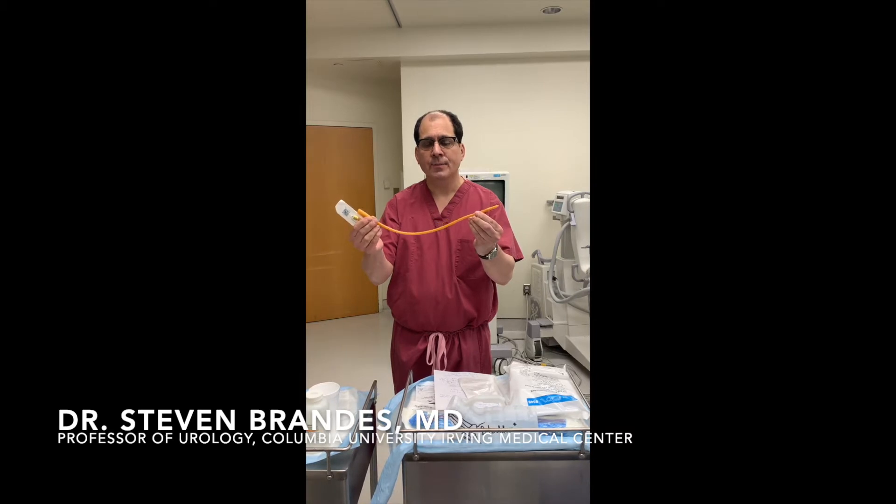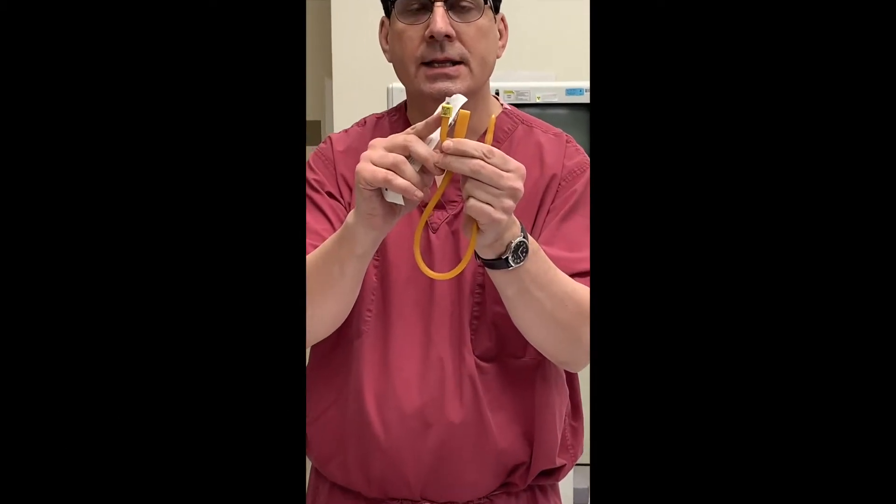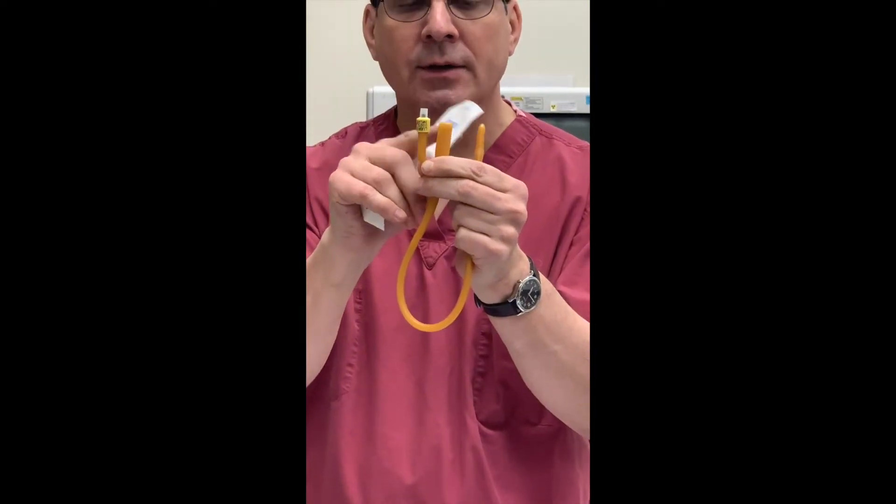This is a Foley catheter. You can see there is a little port on the side — this is the balloon port, and this is where the urine comes out. This part sits inside your bladder.